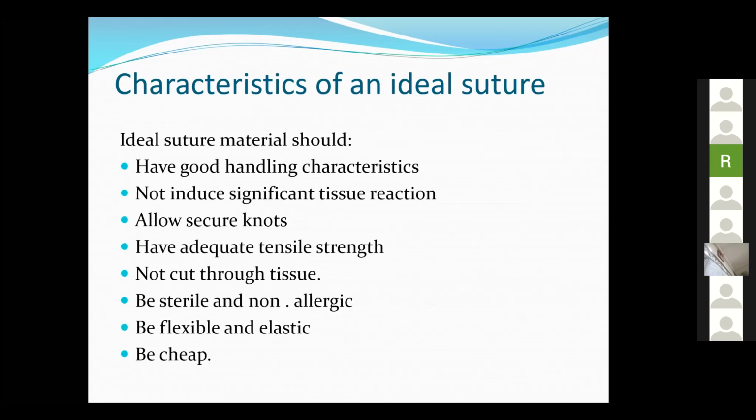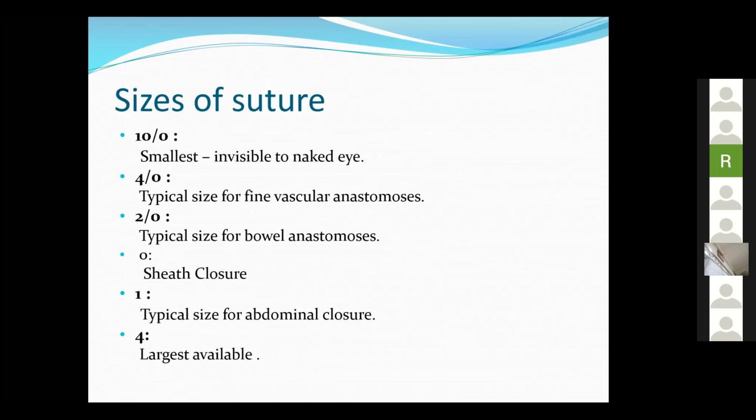It should not lose its tensile strength very early. It should not cut through the tissues. It should be less allergic, flexible, easy to handle, and obviously it should be cheap. So let's see how the suture material is.